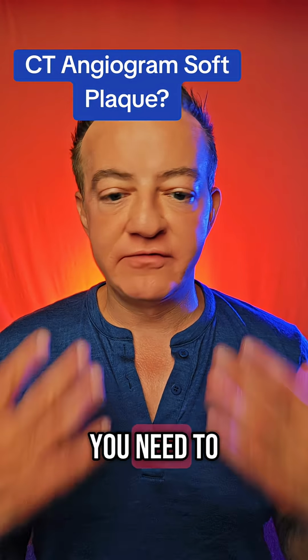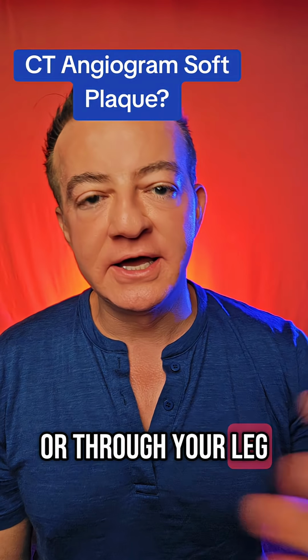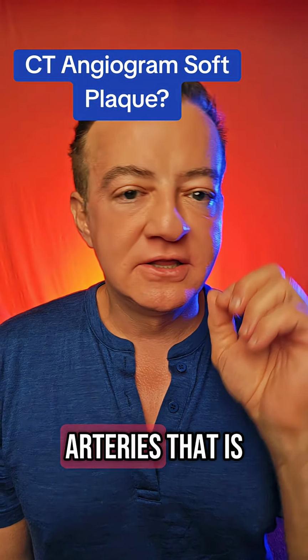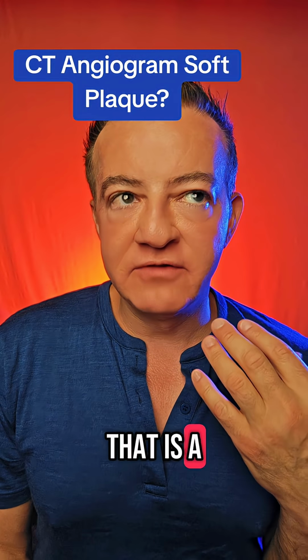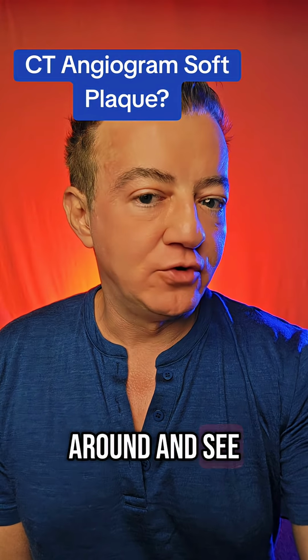But it's invasive. You need to have a heart cath. You need to be in a cath lab. We need to go in through your arteries, through your wrist or through your leg. That is not benign. That is an invasive procedure where we are going into your arteries to look around and see if you have plaque.